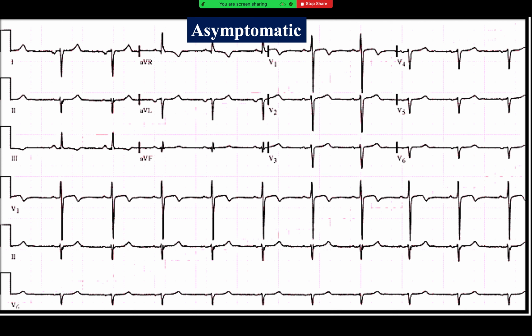In this, the patient is in sinus rhythm. The axis is right axis deviation. However, in lead I and aVL, if you notice, there is a negative QRS. And in aVR, it is positive. So a lot of times someone may think that there may be lead reversal, but there is no lead reversal. In fact, if we look at the left precordial leads, there is progressive reduction of the RS amplitude.